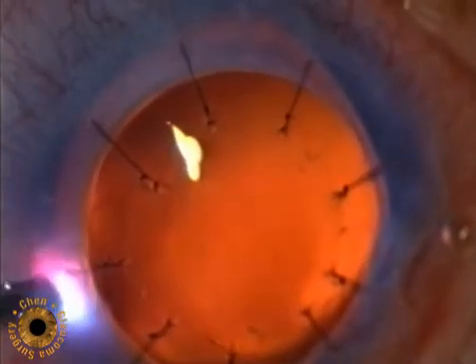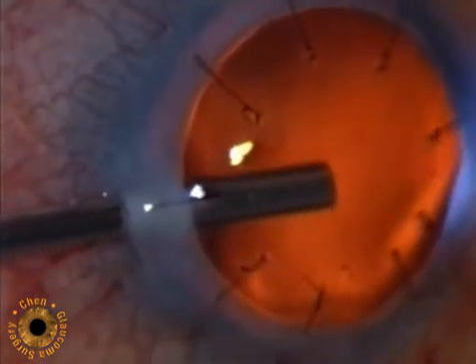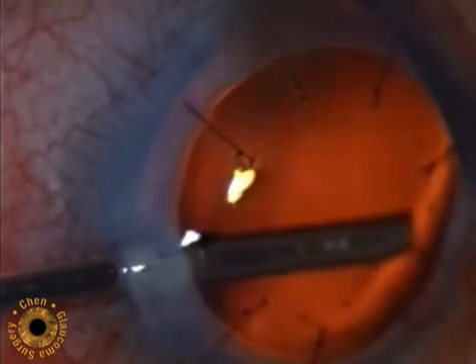The 18-gauge ECP probe is then inserted through the entry site to gain access to the ciliary processes.